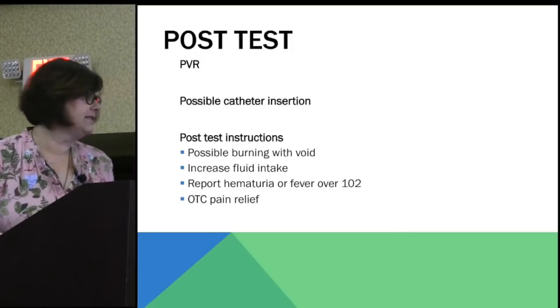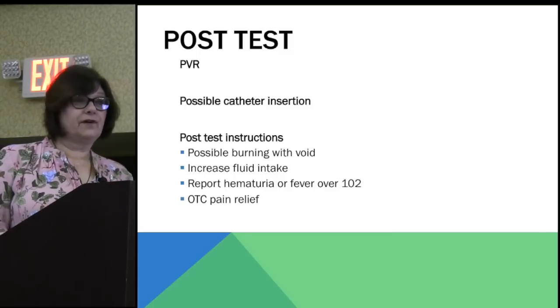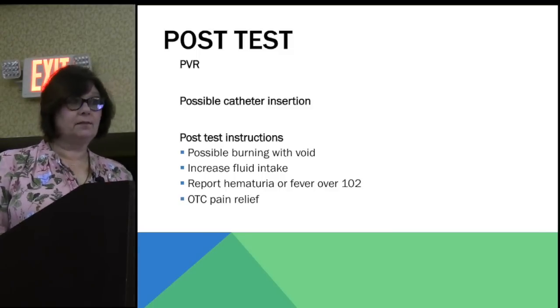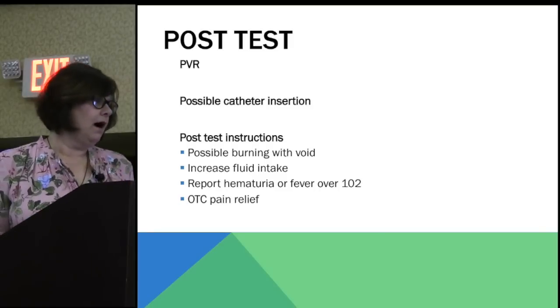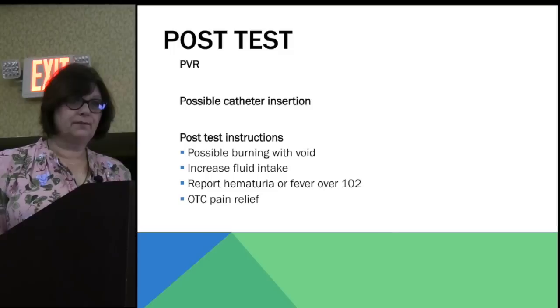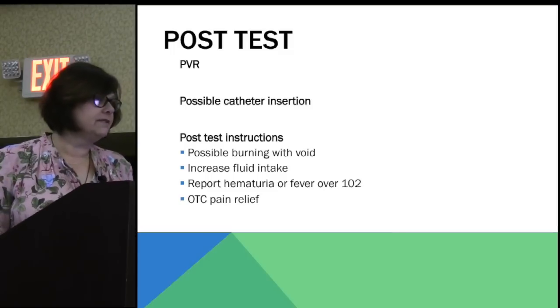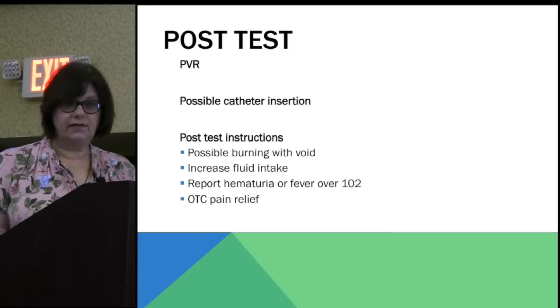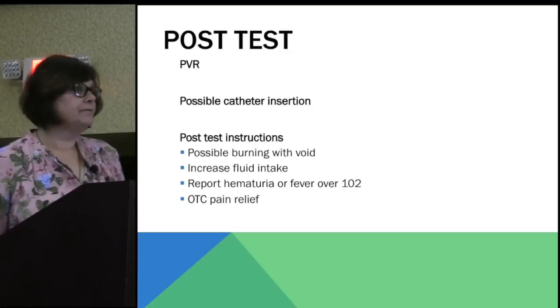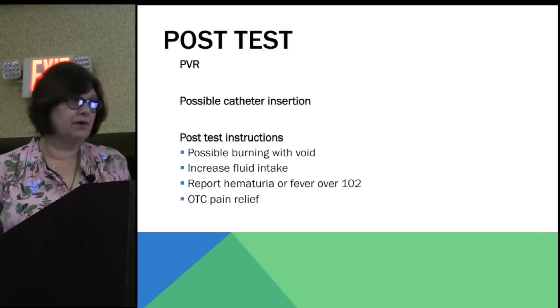Okay, so post-test, sometimes you'll have to put a catheter in, and this might be the first time that the patient has ever had a catheter, but you found on the test that their bladder does not empty. And so they might be going home with the Foley in place. That's why we did this test, to figure out what's going on. Of course, that's a whole situation that you need to sit down and discuss, and not many people are happy about that. But again, we want to talk to them about protecting their kidneys and their health in general.